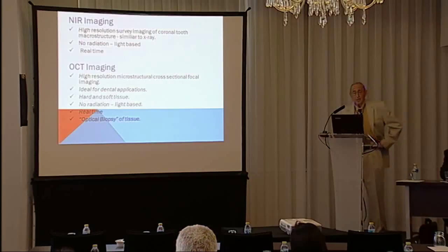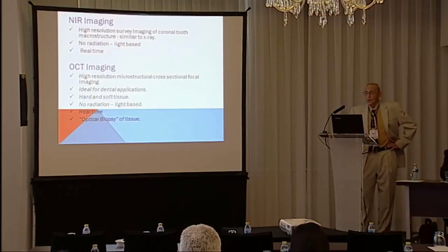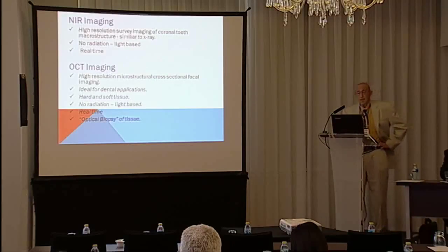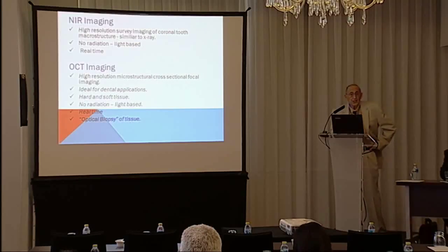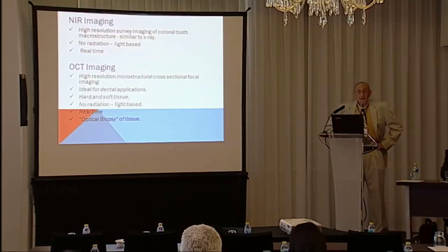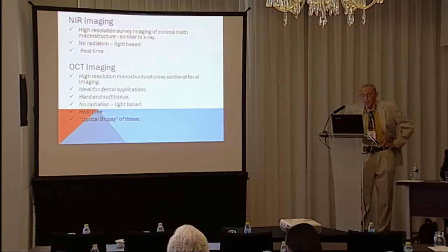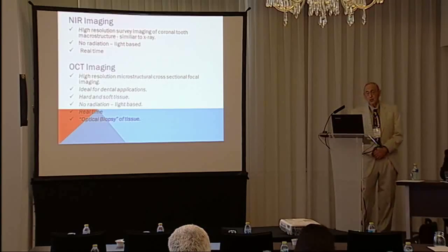NIR imaging, near infrared imaging, has high resolution, survey imaging of coronal tooth macrostructure. It's similar to X-ray, but you have no radiation. It's light-based and real-time. OCT imaging is high-resolution microstructure cross-sectional focal imaging. It's ideal for dental applications. You get hard and soft tissue.